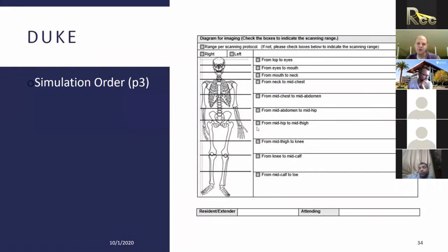Now I will note that sometimes we'll get complaints from our physicians saying, I could only select these two, but you didn't have to go that high. So I don't know if this is the best way to delineate what area needs to be scanned, but this is kind of what we do.